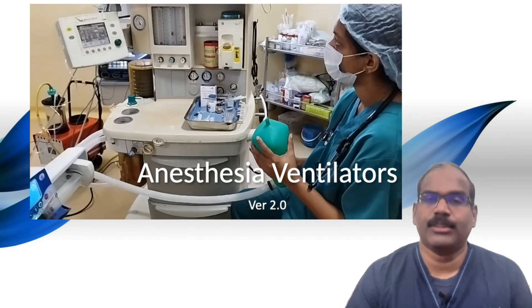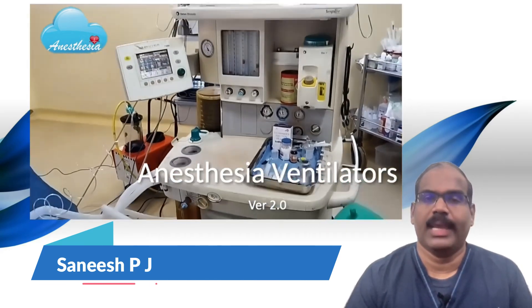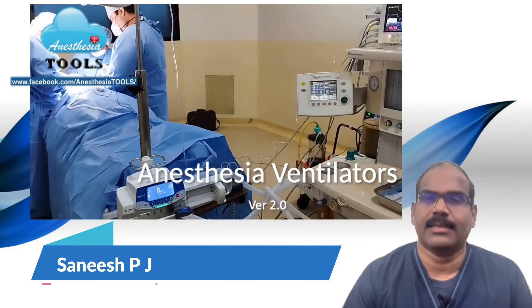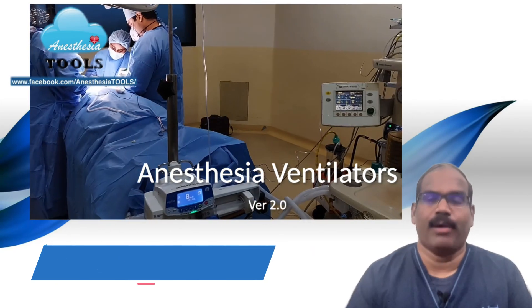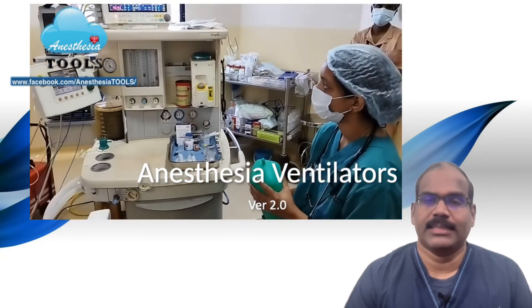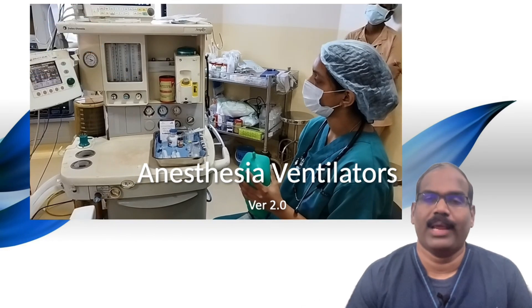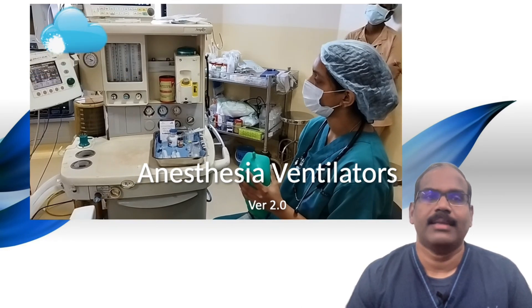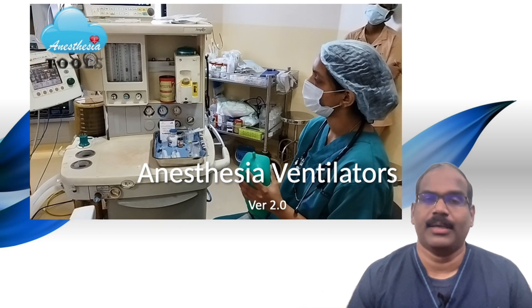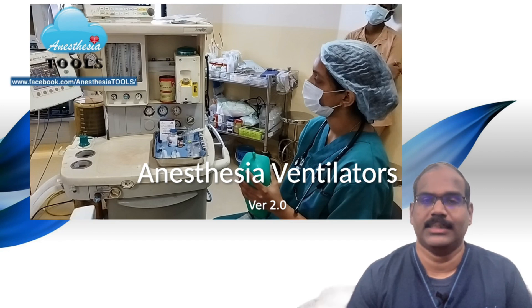Automatic ventilation began to be added to anesthesia machines after the Second World War. Early anesthesia machines had a breathing system which required the clinician to manually squeeze the reservoir bag to ventilate the patients. Today's anesthesia workstation ventilators incorporate ICU-like capabilities including a variety of ventilation modes and the ability to allow patient triggering. I am Dr. Saneesh welcoming you to Anesthesia Tools once again for a discussion about modern anesthesia ventilators.